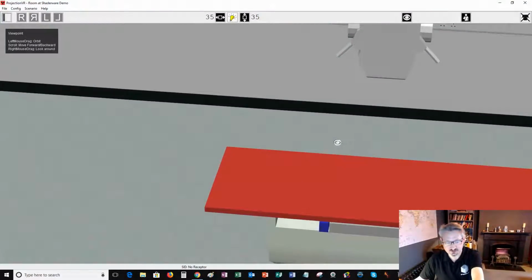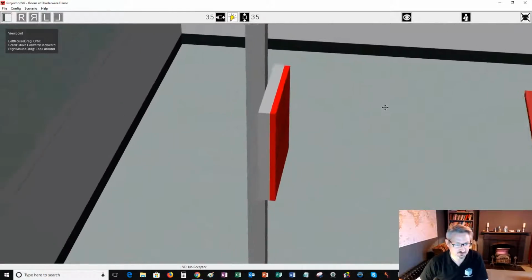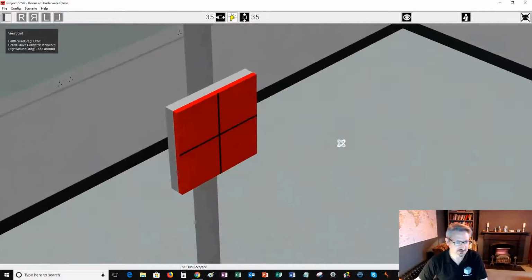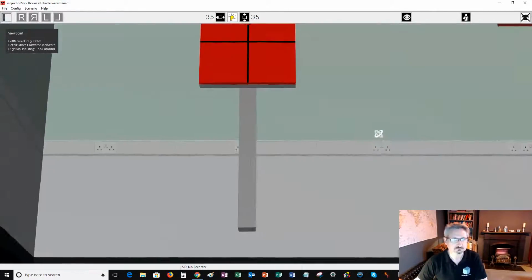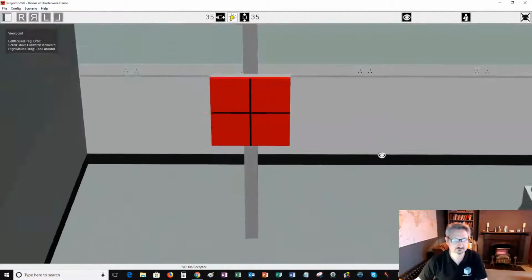But what if I don't want to look at this bit? I want to look at the erect bucky. So what I need to do is move my point of view over to the erect bucky. So I use the right mouse button, sorry. And if I click that, then I get this translation cursor, which allows me to now indicate that I'm moving my point of view. So if I move my point of view over to the erect bucky, now when I spin round, I'm actually looking at that from different angles. Okay, and I can zoom in and out of that.